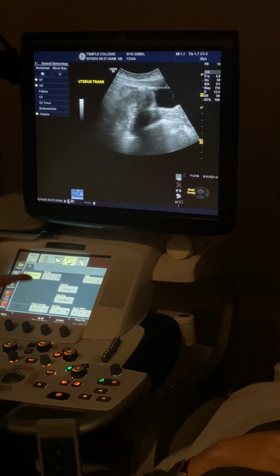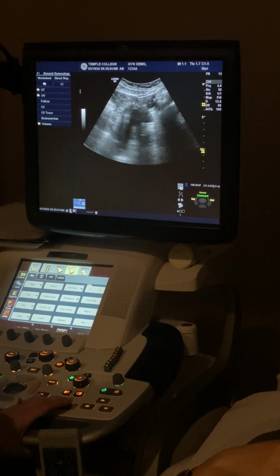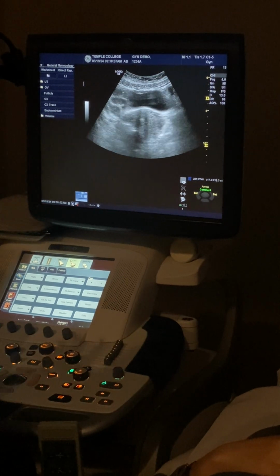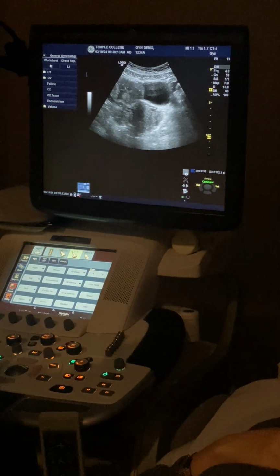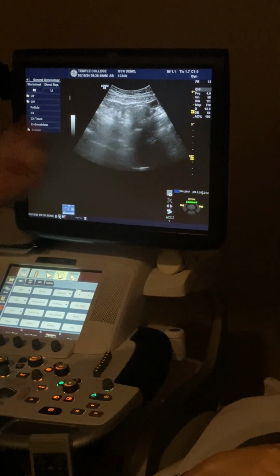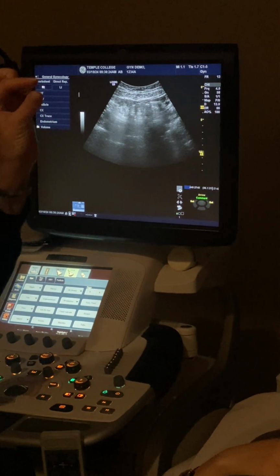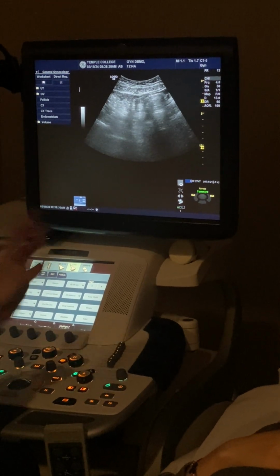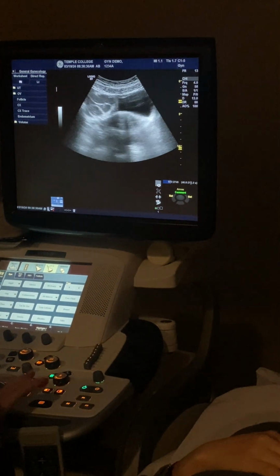That is going to take some practice, just like the ovaries. I don't know if I'm going to be able to do ovaries in her. All right, so we'll just look together. My best suggestion when you're looking for ovaries is to start with your transverse uterus at the fundus and then scan down until you see those tubes branch off. You might not be able to see the tubes themselves, but you can see the area that they're coming off at. So it gives you more of a target zone to search instead of just scanning all over the whole pelvis, being like, ovary, reveal yourself. It's harder that way, trust me.